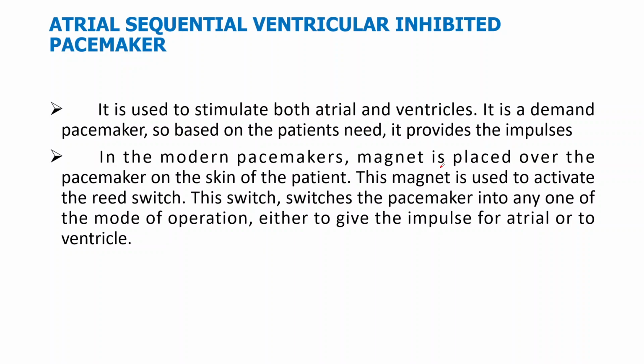So in total, we have discussed five types of pacemakers here. Each depends upon the need of the patient, and the method of pacemaker will be selected for the patient accordingly.